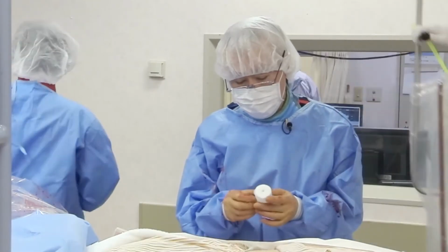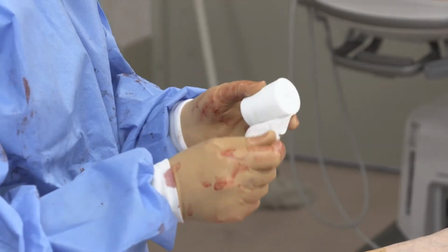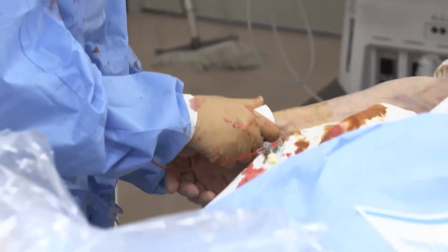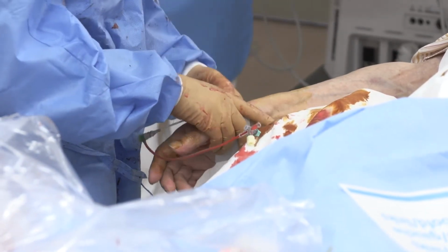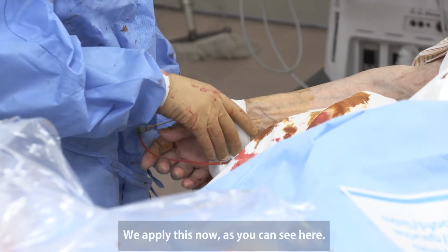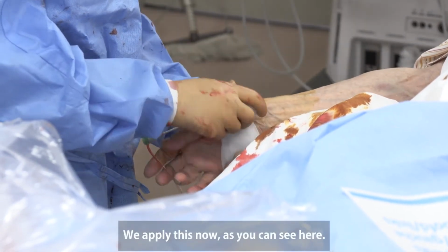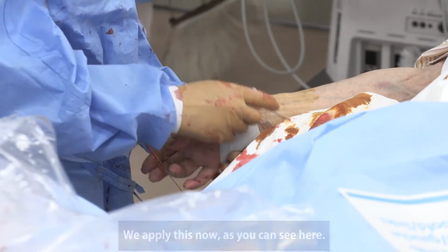And this is a bandage, made of very elastic fabric, and we apply this now, as you can see here.